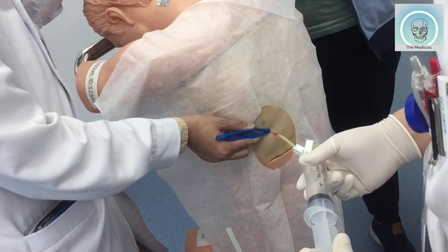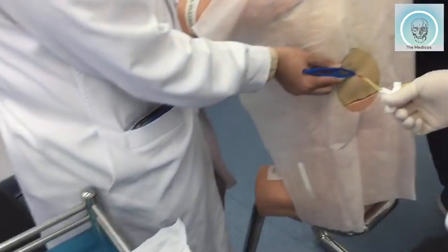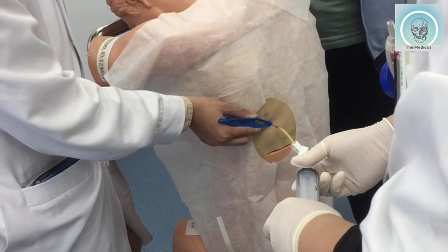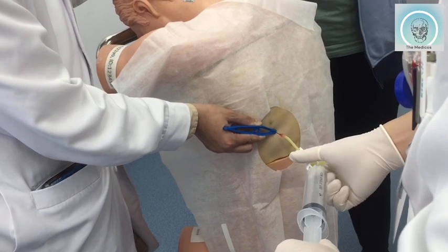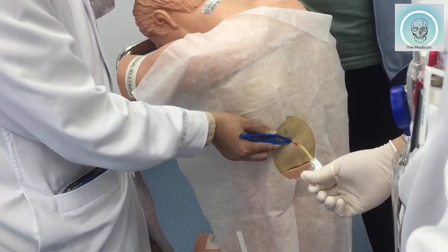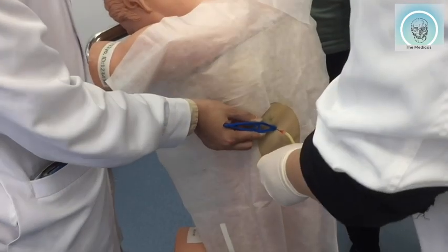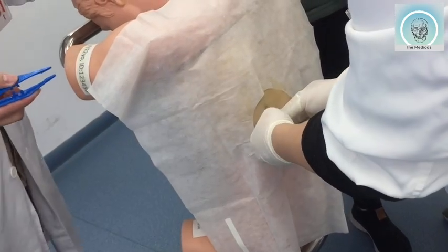But the first time we usually have an upper limit, so we maximize the volume of the drainage. The first time is 600 milliliters. Yes, the first time. And the second time, the upper limit is 1,000 milliliters. Okay.